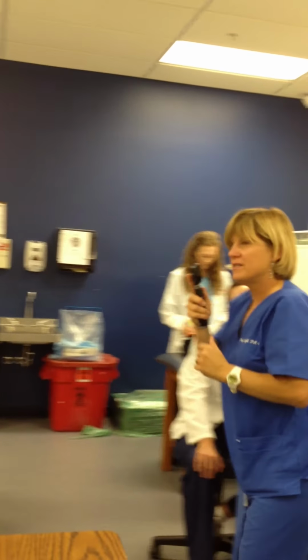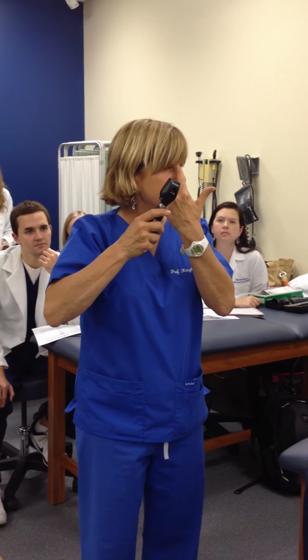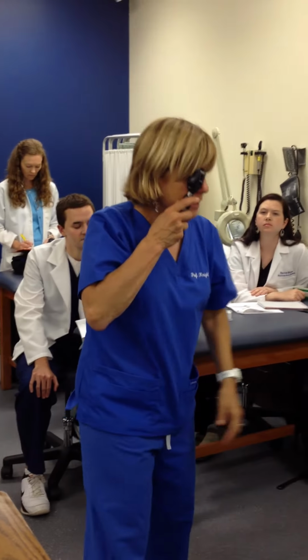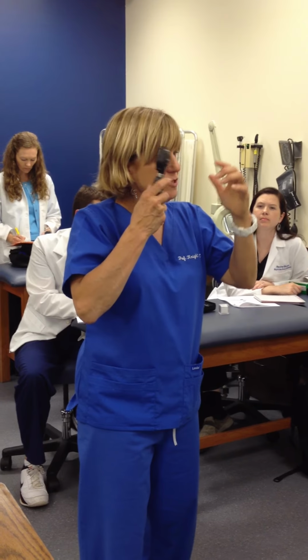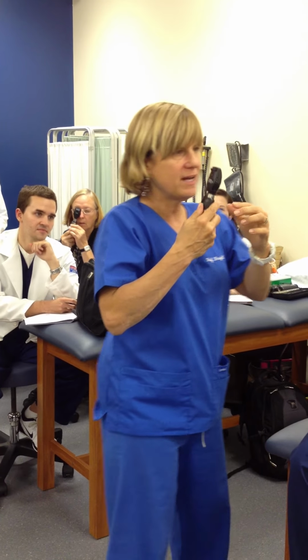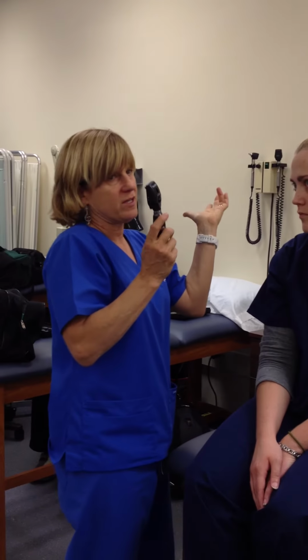Good. One of the things, again, when you're holding this scope, you want to minimize the amount of movement, okay? So if you can hold it here and keep it pressed against your nose, the nasal bone, and right here against your eye, and now you kind of move as a unit. That eliminates some of it, rather than just being out here. And then once you spot the light reflex, then just drive straight in.